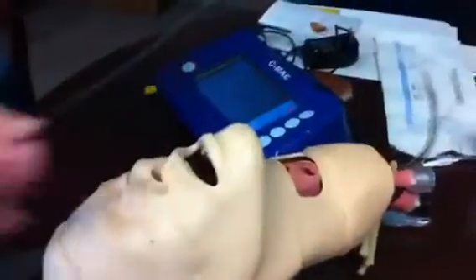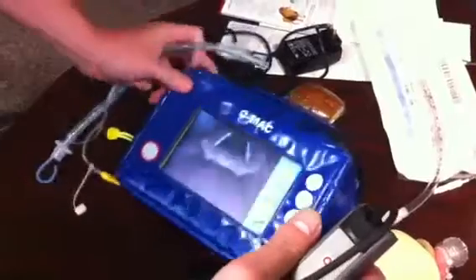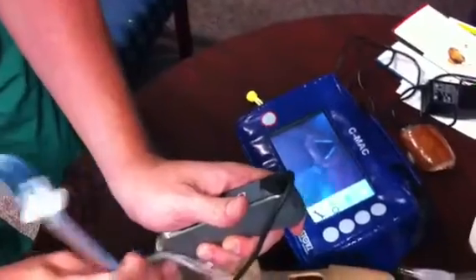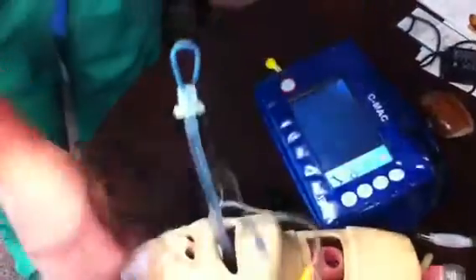When you're ready to use it, place it inside the patient's mouth, making sure you don't hit the teeth. Look at the screen and you'll see the vocal cords pop up. Take the ET tube and put it right down the middle — you can view it going through the cords. And then you're done.